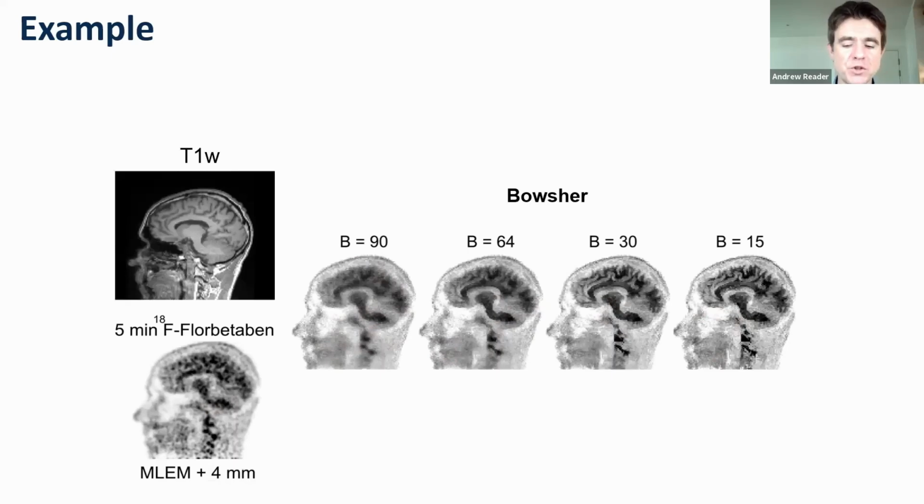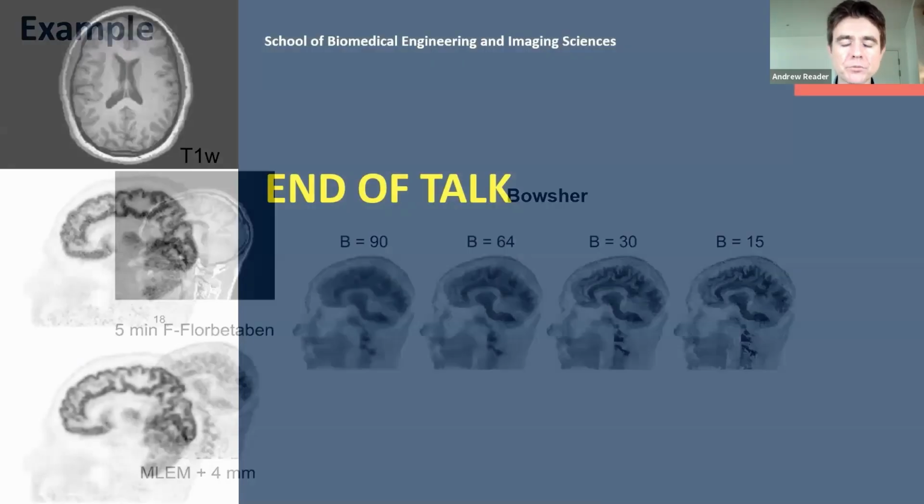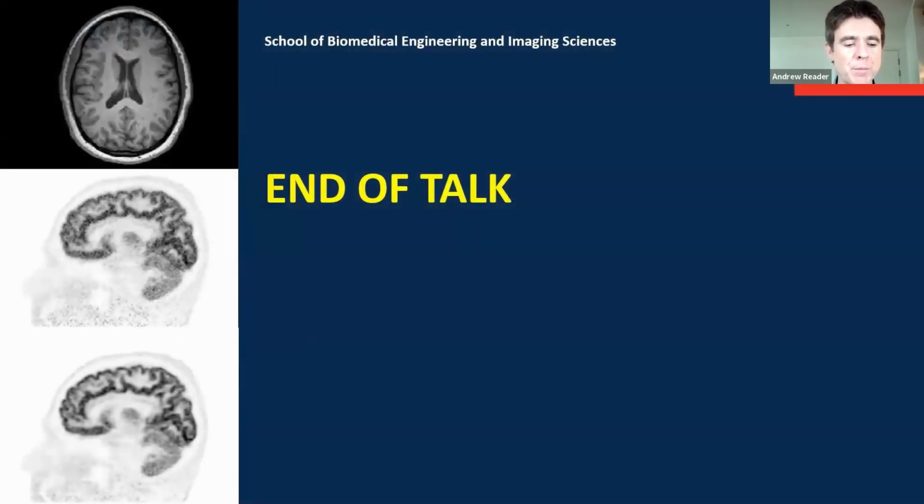But I hope that's explained to you the foundations of MLEM, how we use OSEM to accelerate it, and how we can just do a denoising plus, if you like, a delay based on the current update for a quadratic neighborhood difference penalty, used in the De Pierro method.